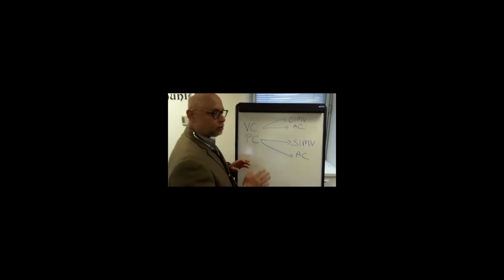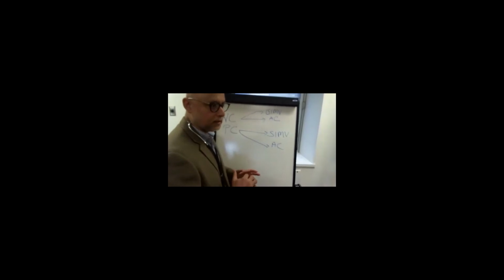Again, the I:E ratio, the inspiratory time is less, then the expiratory time, which is always a little longer in usual cases, but in ARDS, we reverse it. When we reverse it, it becomes an inverse ratio, so either 1:1 or 2:1 or 3:1. I haven't done 3:1, but it can happen too. So that is another thing. For people with COPD, we give a longer time to exhale, but they may change. If they develop ARDS, we may have to change the setting.